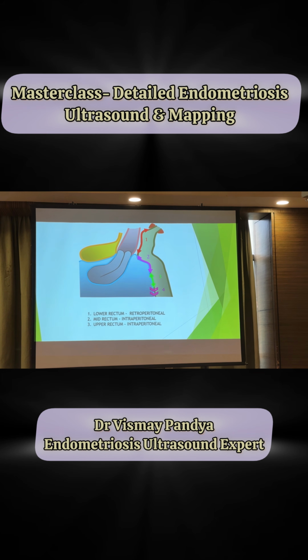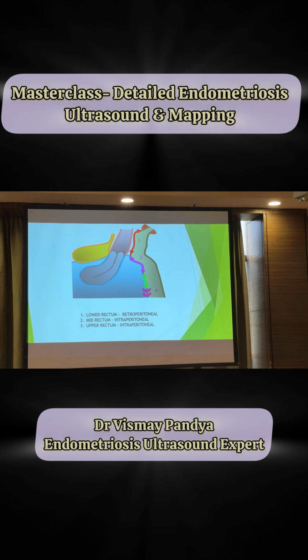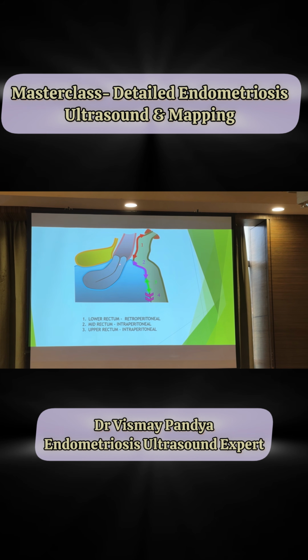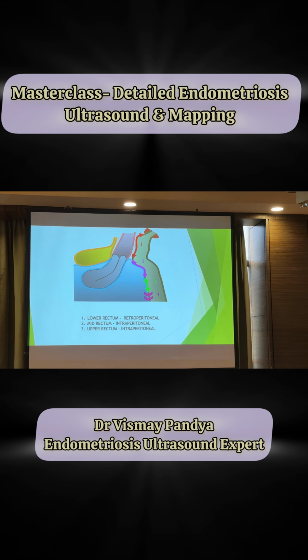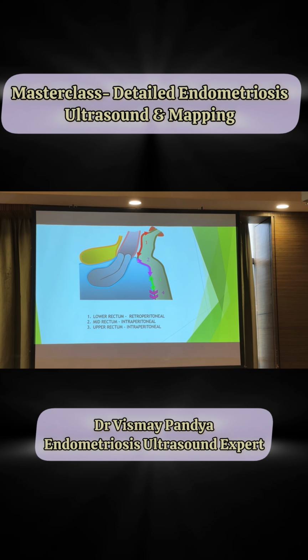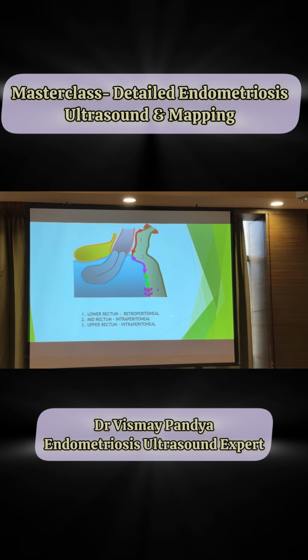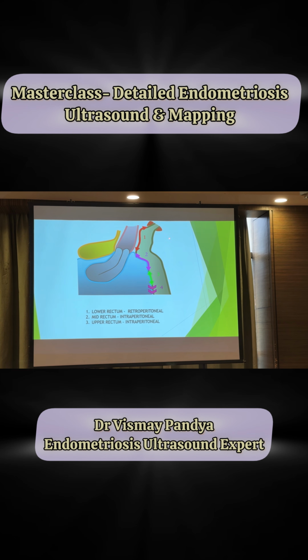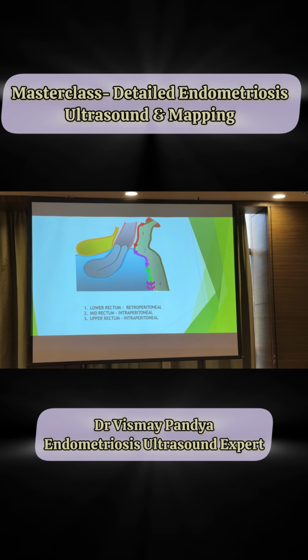So we have got the nodule, but how to localize it? In the MRI they give that it is 15 centimeters, 20 centimeters from the anal verge. So there is a predictive criteria for diagnosis. It's quite simple. This is the cervical internal os. This is the torus. If there is a nodule at the torus, it's an intraperitoneal nodule. Because as we know, the peritoneum covers here the POD. So everything lower down the POD will be lower rectal, retroperitoneal. Now why is it important? Because low rectal resection will require a multidisciplinary approach, and the prognosis is very prolonged for such patients. And anything above this is intraperitoneal.